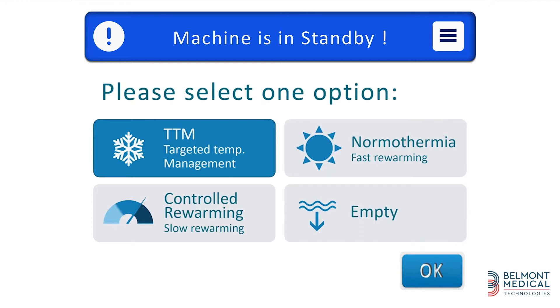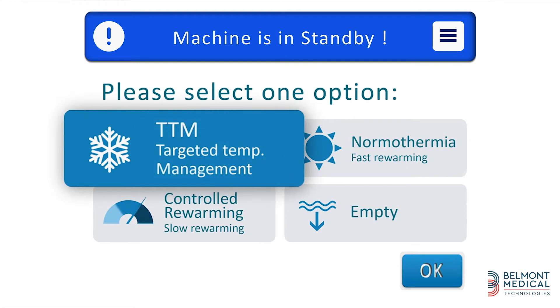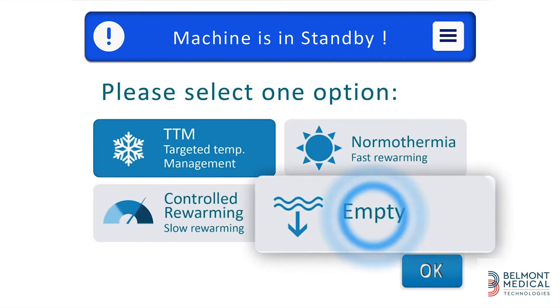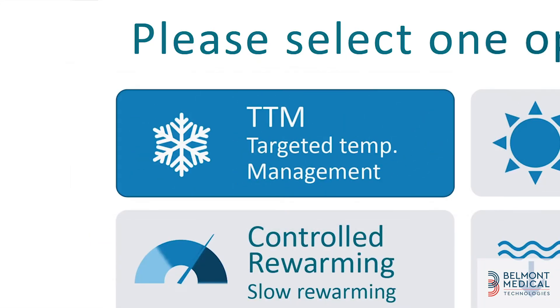Now you can select the operation mode. The options are targeted temperature management, normothermia, controlled re-warming, and empty. Select TTM for controlled targeted temperature management. This is the default choice.